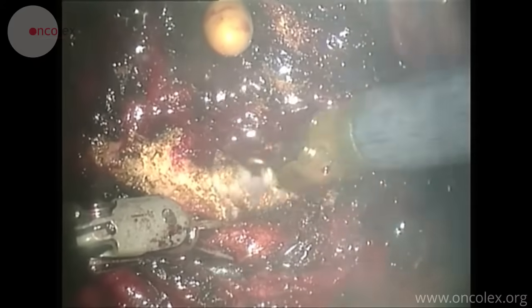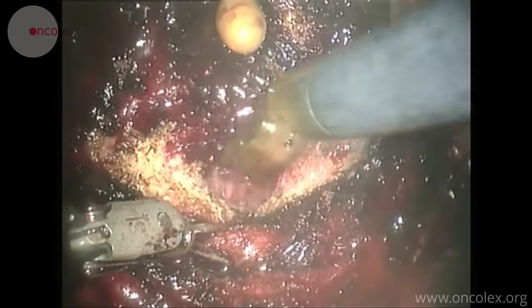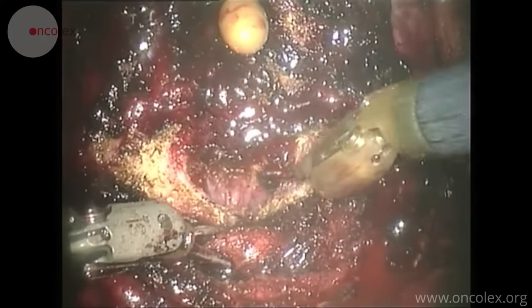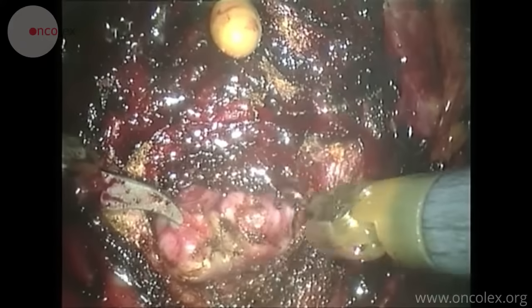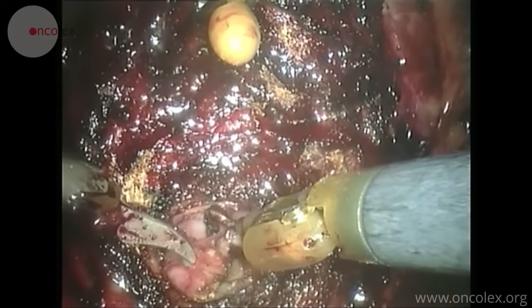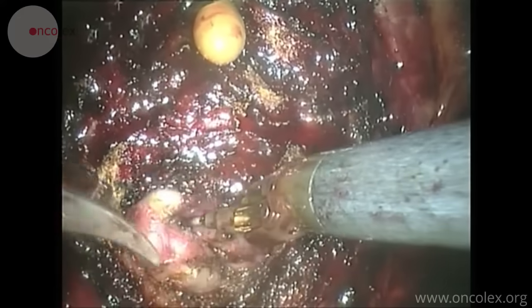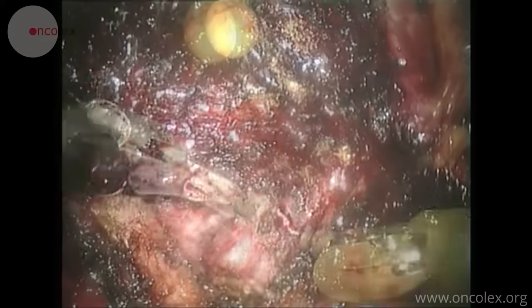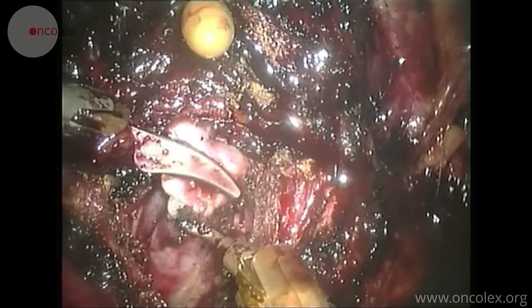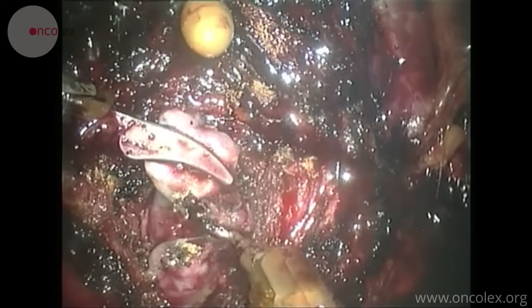The next step is to cut between the layers of the posterior bladder wall and the prostate. Here is the vas deferens, which is cut, followed by the seminal vesicles. These are often cut so the tip of the vesicles are left in place. This is to conserve the erectile nerves, which are located near the tip of the vesicles, as much as possible.